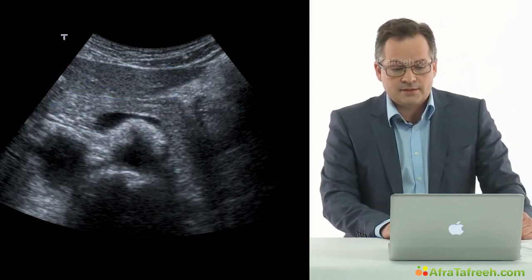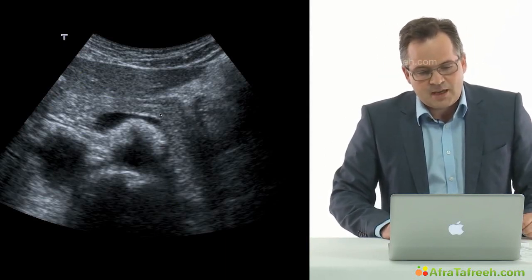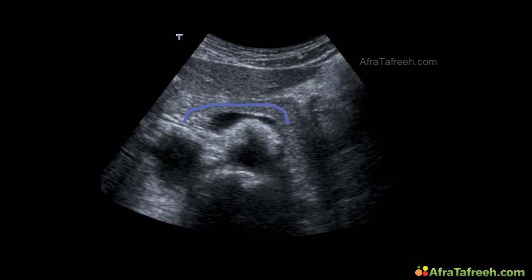Whereas the pancreatic duct, its normal size is 2 to 3 millimeters in younger patients. You can get a glimpse of it over here, I think. Only in this region I have an idea where the pancreatic duct is.